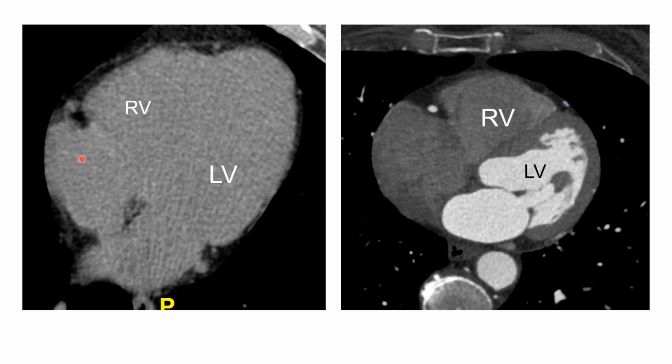These are two images of a similar cut through the heart, and on this side you can see the calcium score. Here on the right you can see the CT angiogram, and the big difference is pretty evident. With this calcium score, there's no contrast, so all of the softer structures like the coronaries and the ventricle, it's hard to differentiate between the lumen of the heart and the myocardium of the heart.